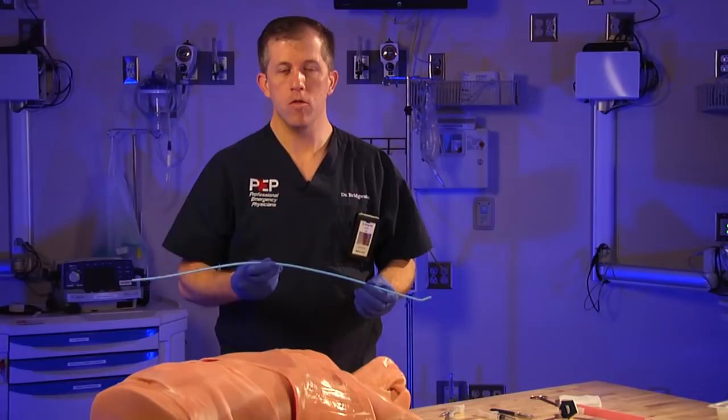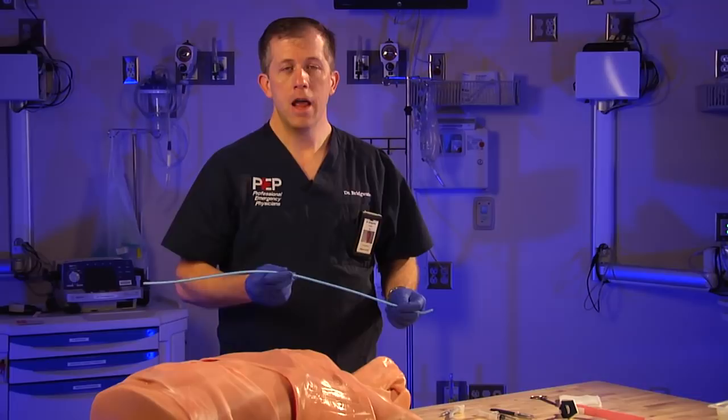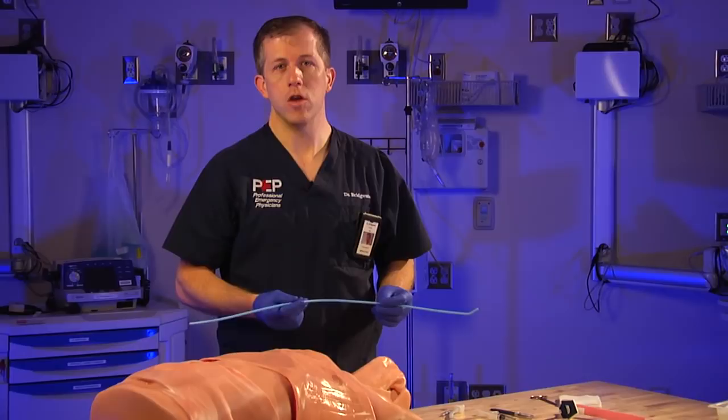The first procedure we're going to talk about today is the Bougie Cric. It's named because we're going to be using the typical bougie, which most of you are familiar with — normally utilized as part of the difficult airway algorithm. But this device has become, over the years since its inception, a great device for cricothyroidotomy, determined to be one of the easiest, cleanest, and quickest ways, making it perfectly adaptable to the MICU and flight environment.